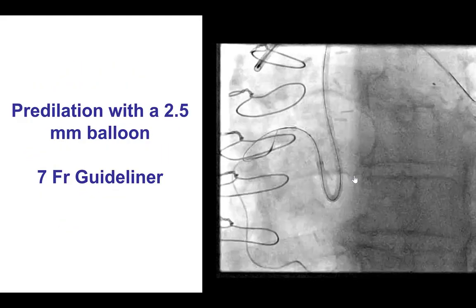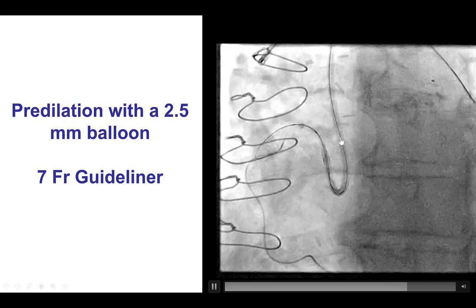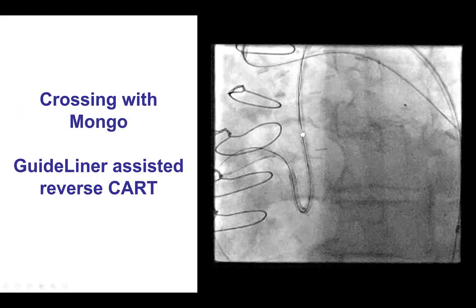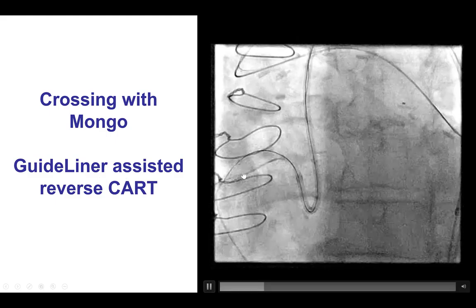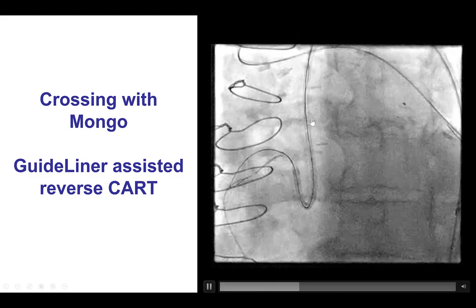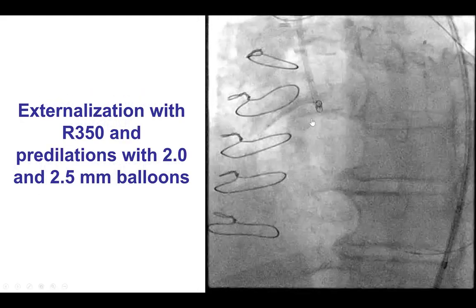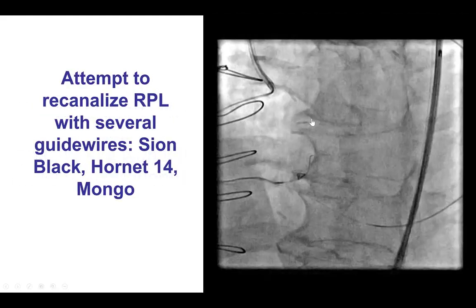We then pre-dilated, inserted a guide extension, and performed the GuideLiner-assisted reverse CART, advancing the retrograde guidewire into the antegrade guide extension. We externalized an R350 and pre-dilated the entire right coronary artery with various balloons.